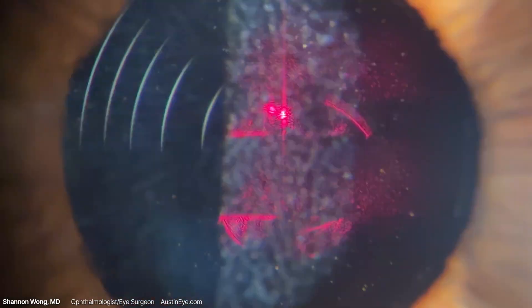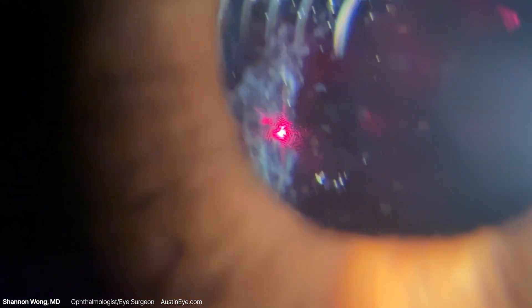We place a lot of single-piece acrylic presbyopia-correcting lenses into our patients in 2024, and some of these patients will express dissatisfaction with their vision after receiving these lens implants. The surgeon will see posterior capsule opacification and perform a YAG laser capsulotomy to improve the patient's vision.